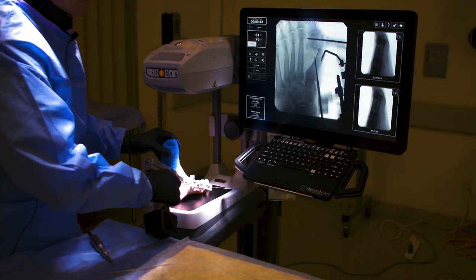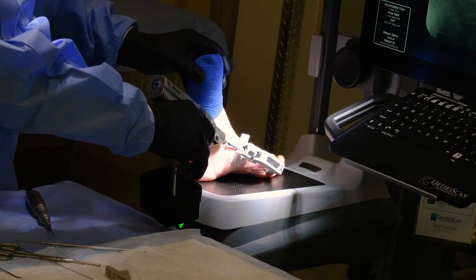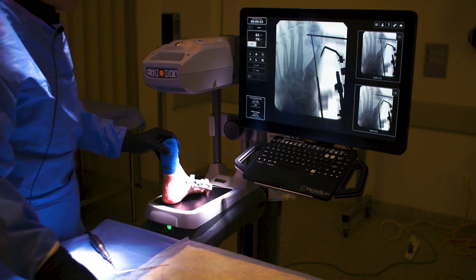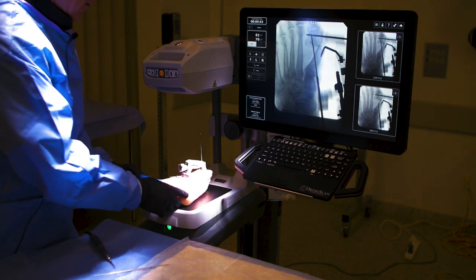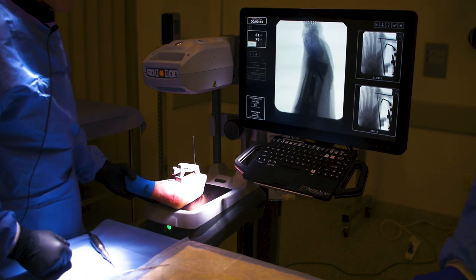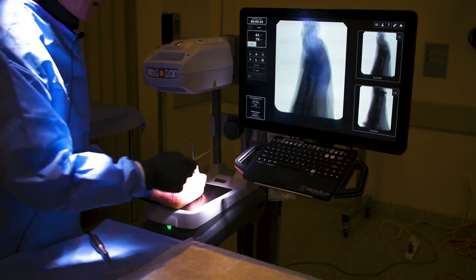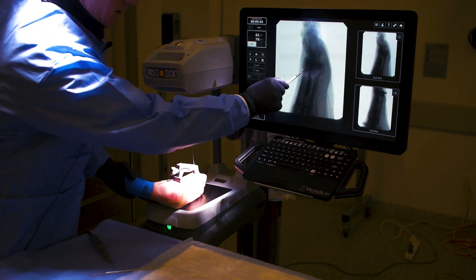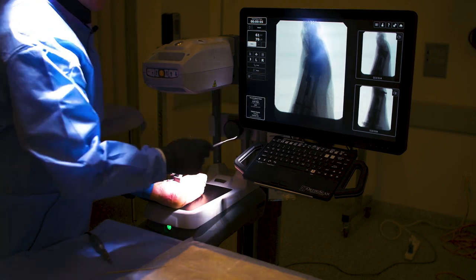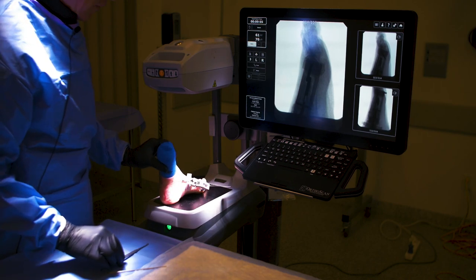On AP it's exiting at what I think is a good point and should go into the head well. I advance a little more — I feel bone — and I'm past where I want to go. On AP I'm extremely happy. Looking at the lateral to see if we're in a good place in the head: the guide is radiolucent so I can see through. There's my pin in the head — center of head, here's the tip of my pin — this is ideal. Now we'll get our second guide wire in.